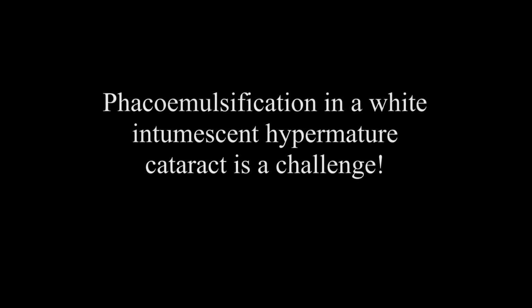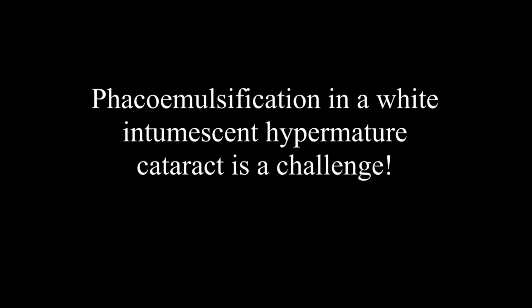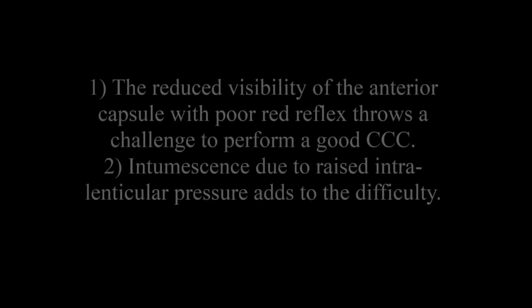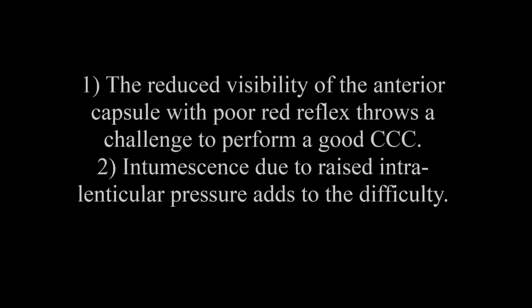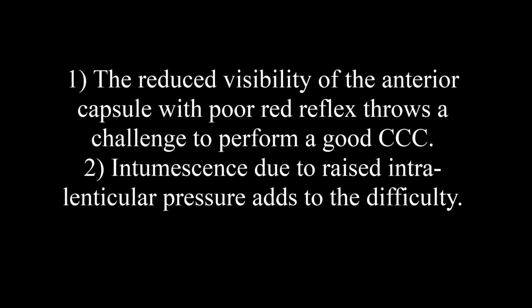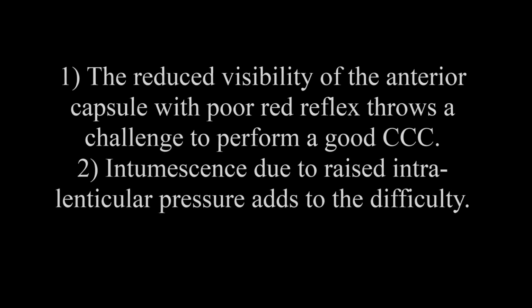Phacoemulsification in a white intumescent hypermature cataract is a challenge because of two reasons. One, the reduced visibility of the anterior capsule during CCC because of poor red reflex, and raised intralenticular pressure in intumescent hypermature cataract adds to the difficulty.